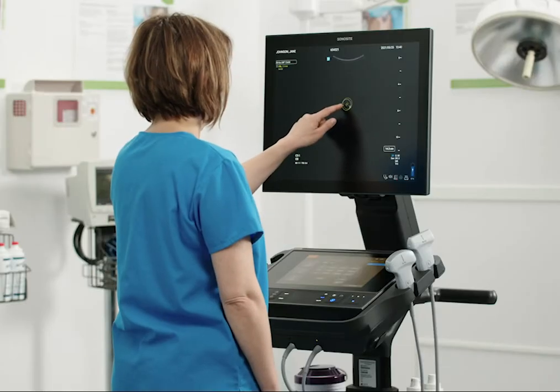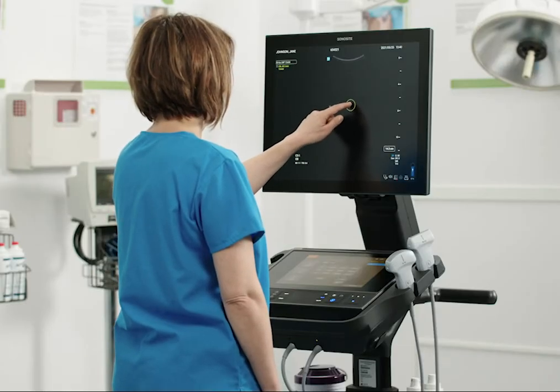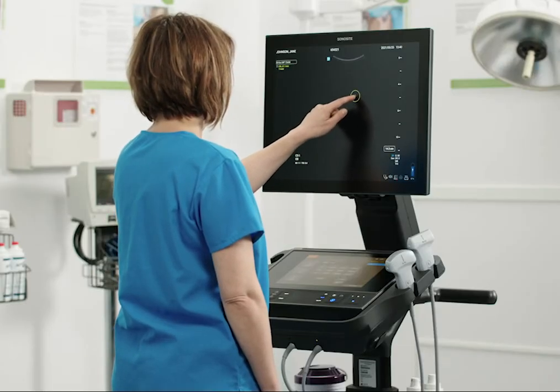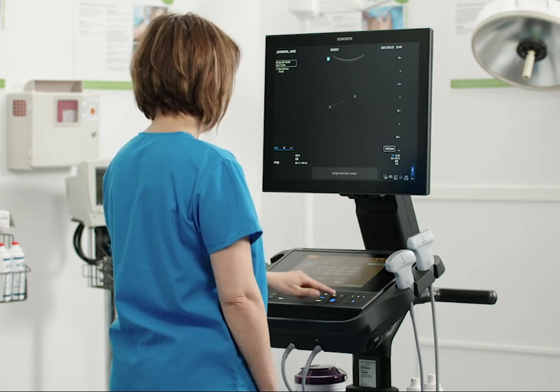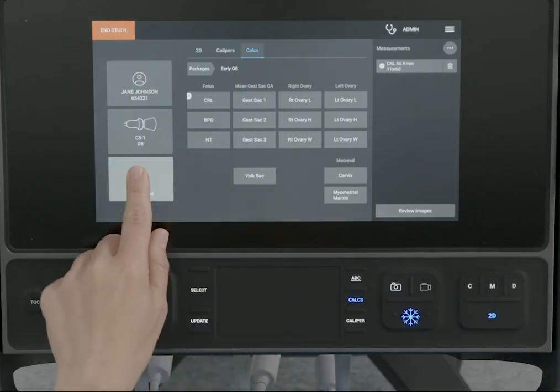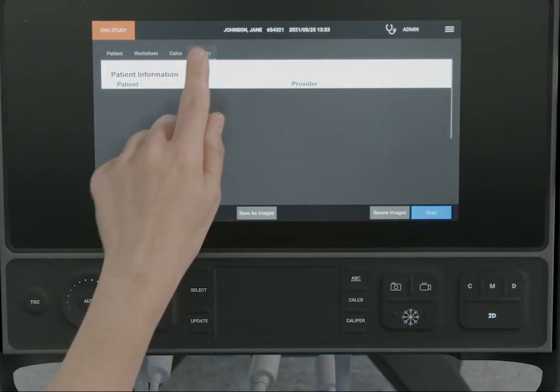You may want to navigate multiple menus to find the measurement you want. Use the calipers to make your measurement. The measurements are automatically saved to the patient report.